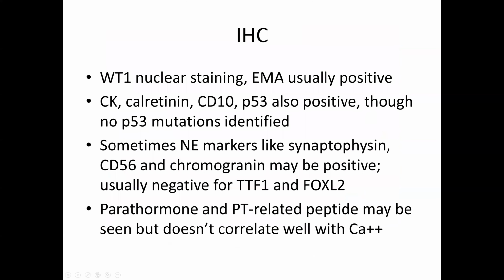The immunohistochemistry can be helpful. So WT1 nuclear staining and EMA are usually positive, which you would not see in other small cell malignant neoplasms.